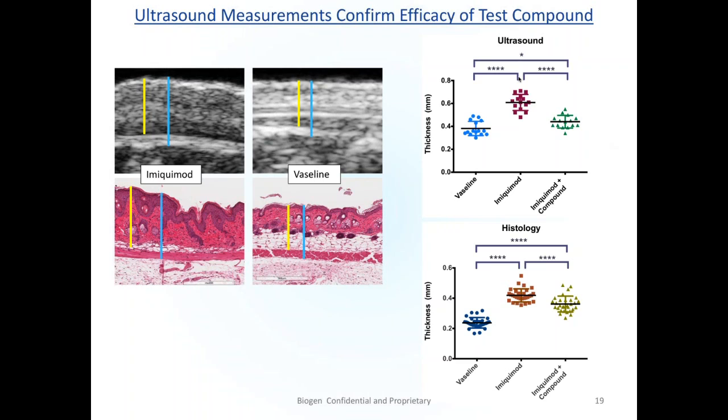You put on as little Nair as possible for the shortest possible time, and then you do extensive rinsing, with warm water and a gauze pad. We've tried to make it as minimally inflammatory and as little of an irritant as possible, but it's a given that you need to get the hair out of the way to get clear images.